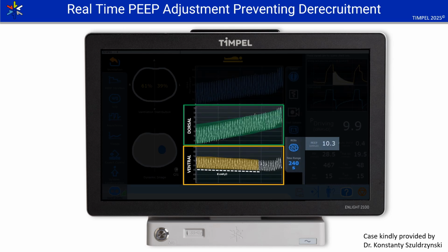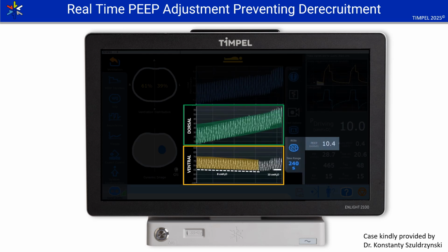So the dorsal region is now in a gravitationally non-dependent position, while the ventral region has become gravitationally dependent. To counteract this progressing closure, the PEEP level was increased from 8 to 10 centimeters of water based on feedback from the plethysmogram, stopping the decline and stabilizing the gravitationally dependent region.